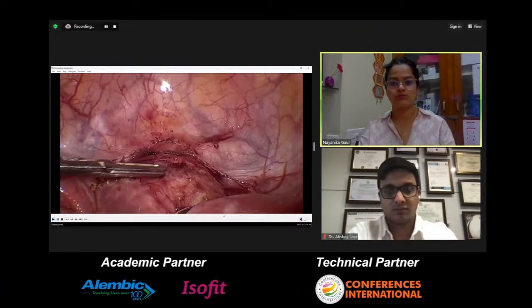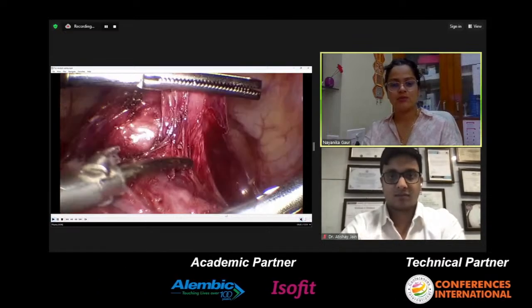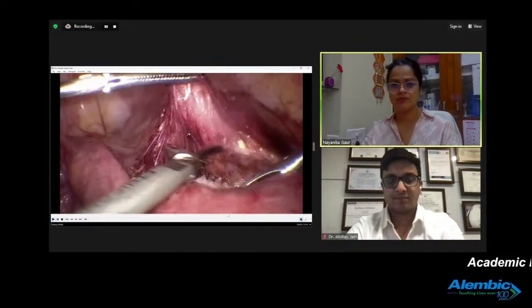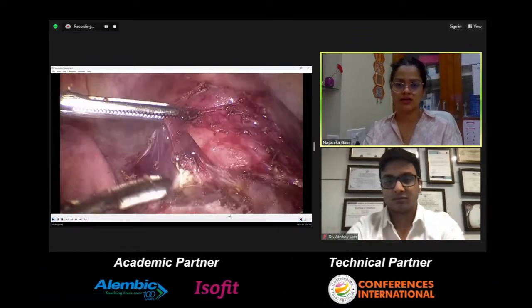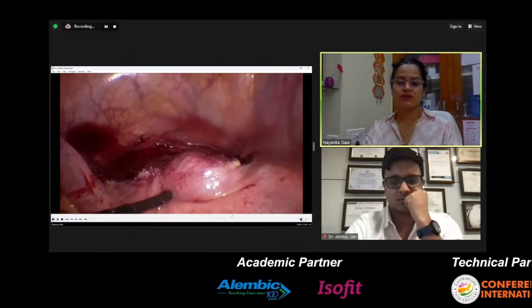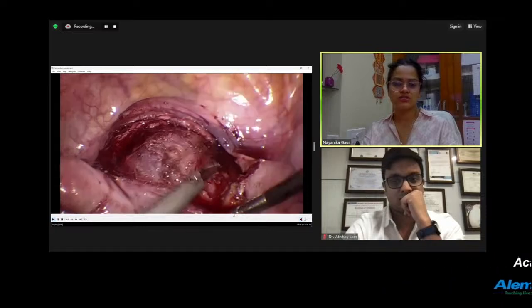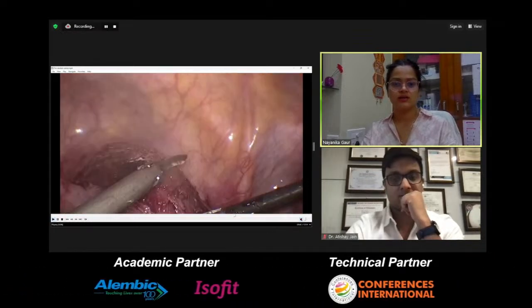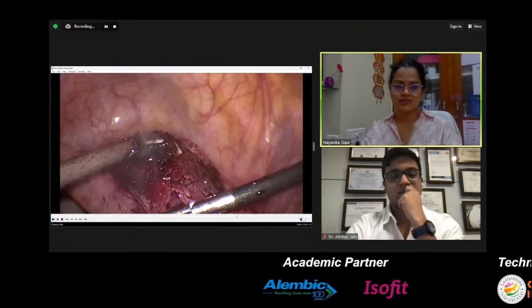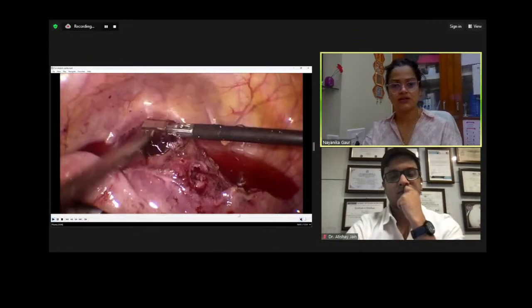So as we took down the UV fold, we saw a big area where the tissue was very thin, and there was a bulge noted. After identifying the bulge, we separated the bladder below and exposed that entire area to a larger extent, because we needed some more space to suture later on. So this was the bulge we found, and we used vasopressin to prevent any extra bleeding. With just a single shot of harmonic, the previous scar rent gave way, and inside we were able to find the clots. These clots were suctioned out, and the rent was thoroughly cleaned.